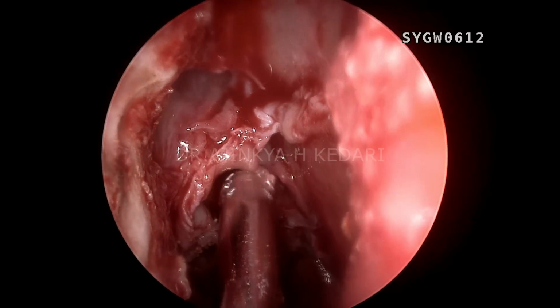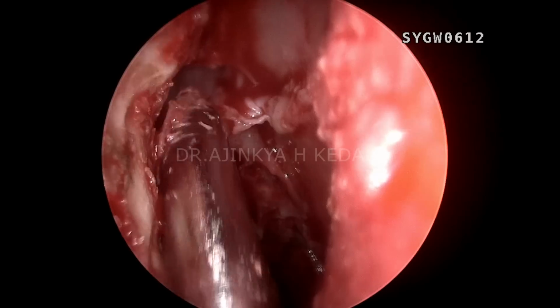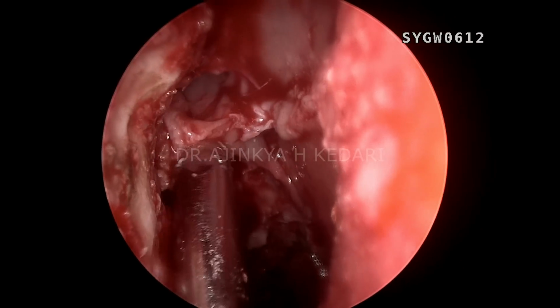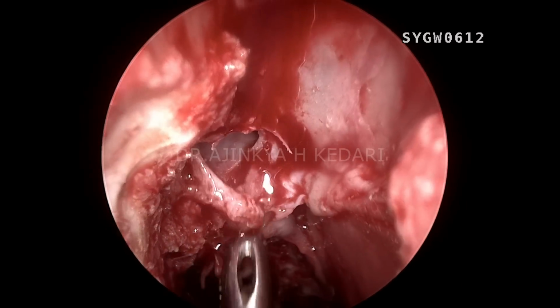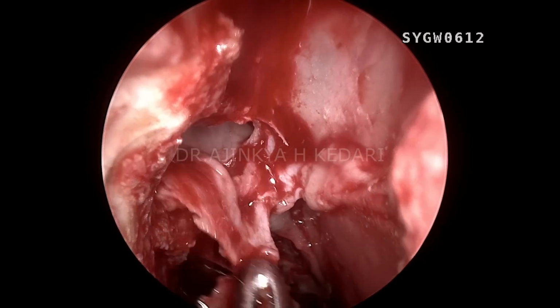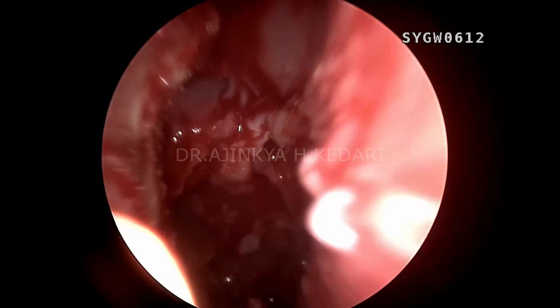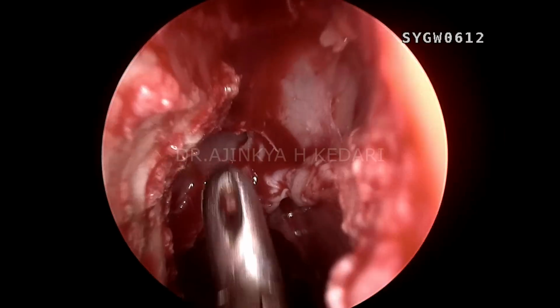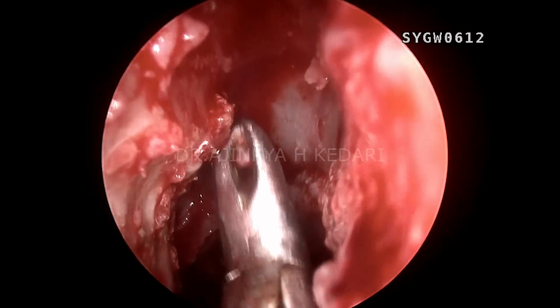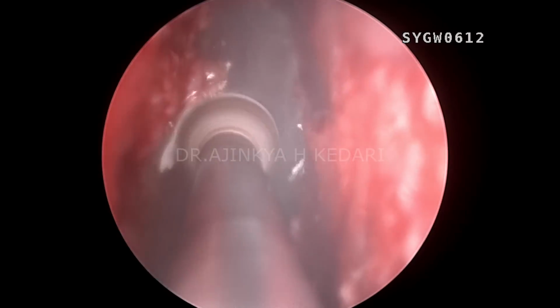At the same time, you can see I'm trying to debride away all that soft tissue just to have more visualization inside. You can use a debrider, you can use an angled forceps, whatever works or suits you. Step by step, I'm going to show you, skipping some steps in between, but the most important points and steps I'll be highlighting in this video. You will be able to see gradually we'll be having a very huge opening head on for the frontal sinus.